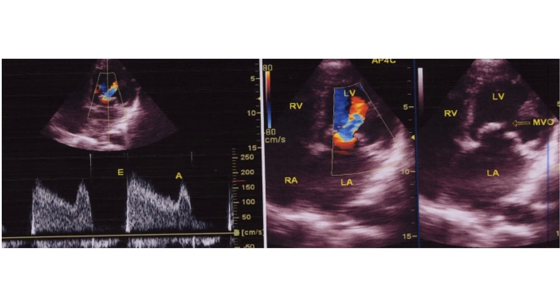The A wave will be absent if there is atrial fibrillation, as seen on the ECG. The upper half of the first panel shows a color Doppler image in the apical 4-chamber view with a mosaic, turbulent jet from the mitral valve into the left ventricle. The mosaic jet is due to the high velocity across the stenotic mitral valve.